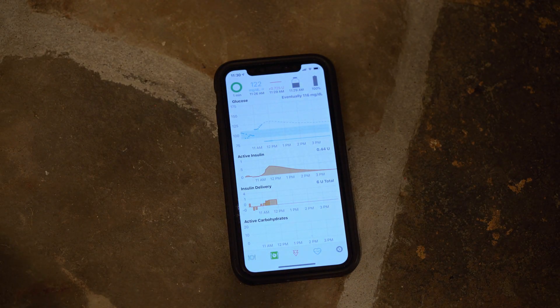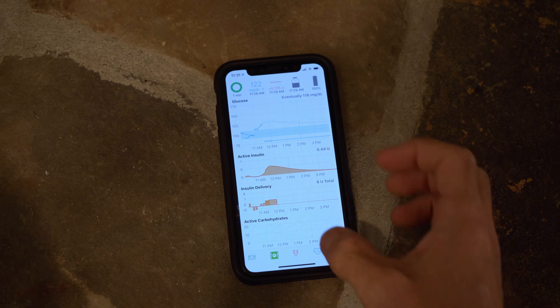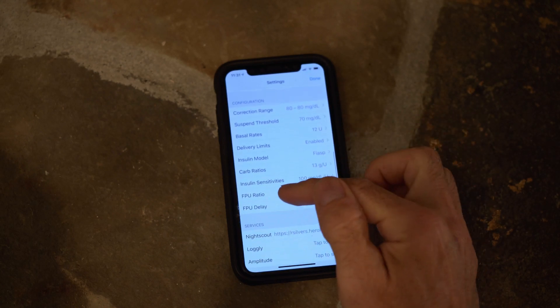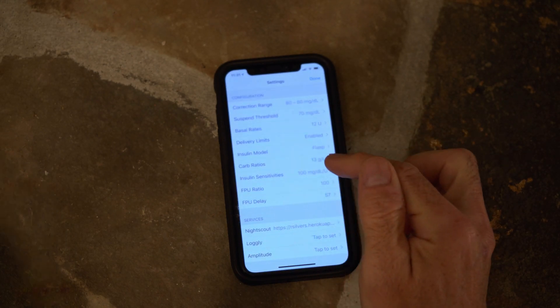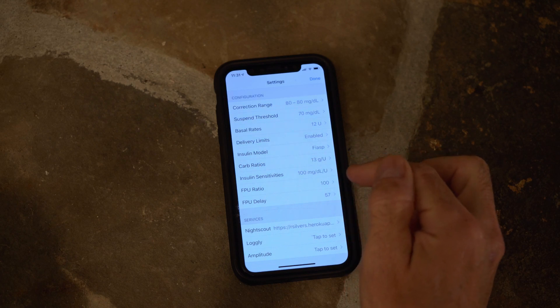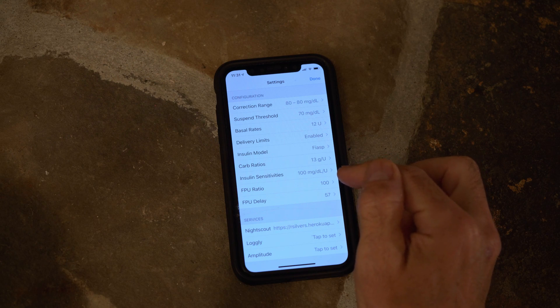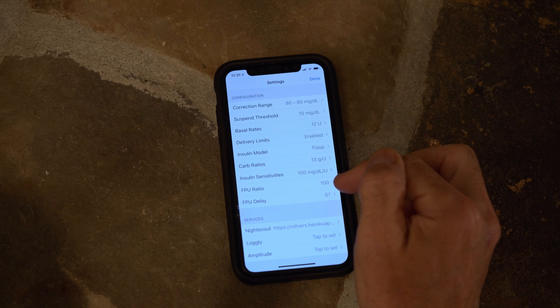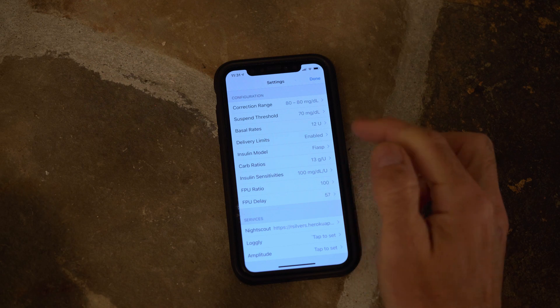Now if we start up Loop, there is a new setting called FPU ratio. It is fat plus protein calories divided by the setting. You can use it much like a carb ratio — the larger the number, the less insulin you will get for the fat and protein. There's also a setting called FPU delay, which is from zero to two hours for most people.